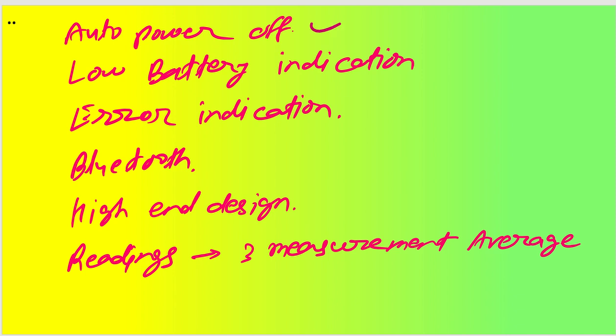It can be auto power off. Let us say you measured your NIBP and you kept the device as it is, so after waiting for around 1 minute or maybe 5 minutes you can keep it off. So it all depends on the software that will be done during the design.